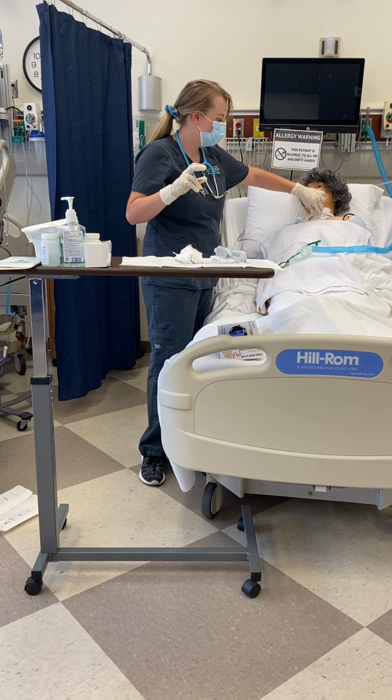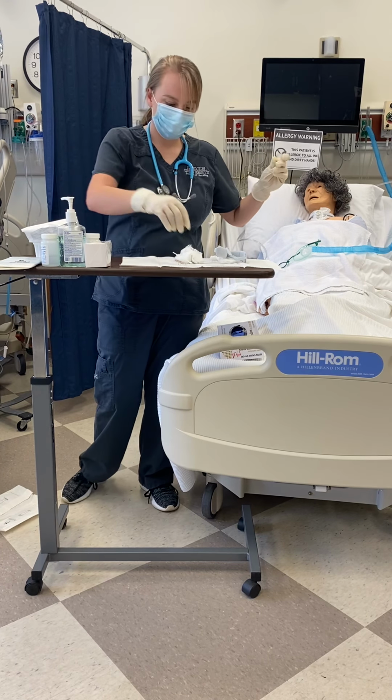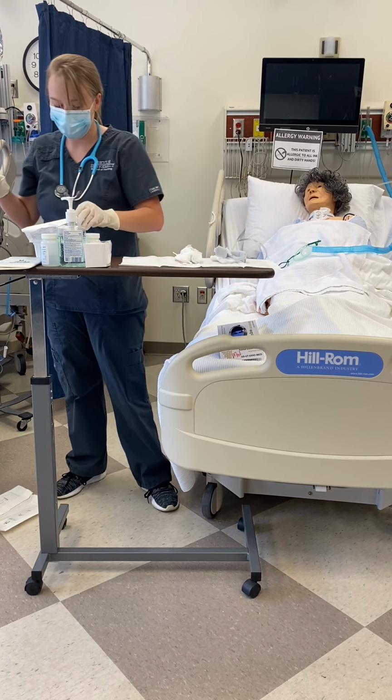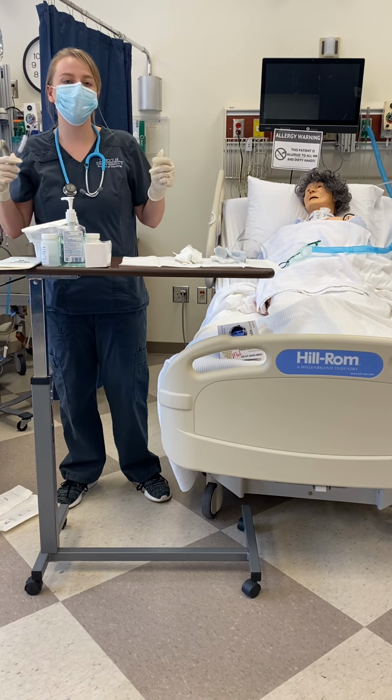and I'll take this inner cannula out and the pipette. I'll put that in there and I will let it soak, let it break down all the mucus and phlegm.